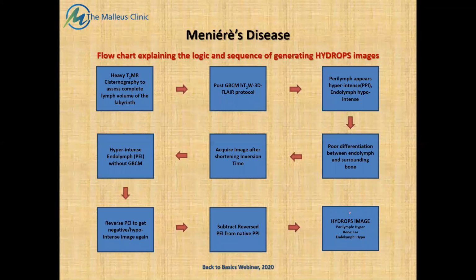I just hope that with this flowchart I've been able to give you a basic idea of what these hydrops images are. I would be very happy if all of us together, from different parts of the world, can do this multicentrically.